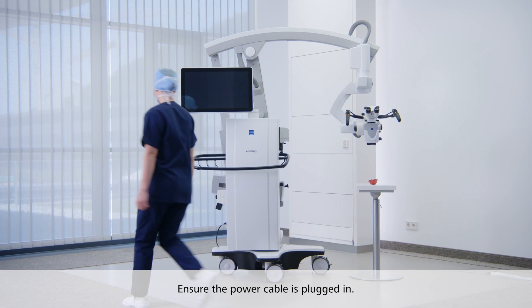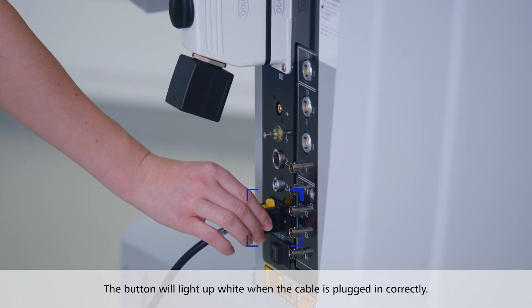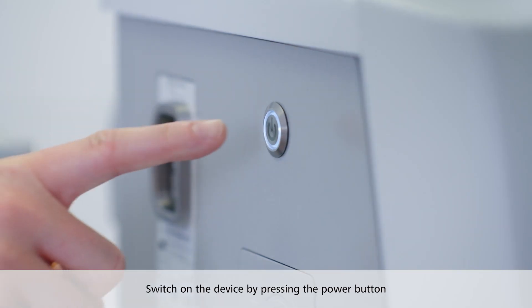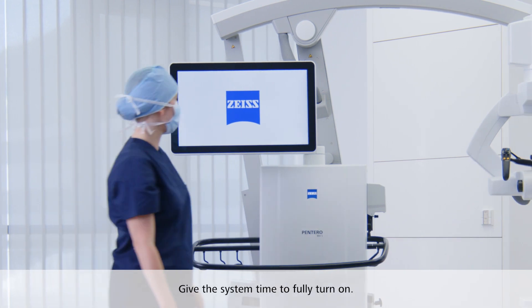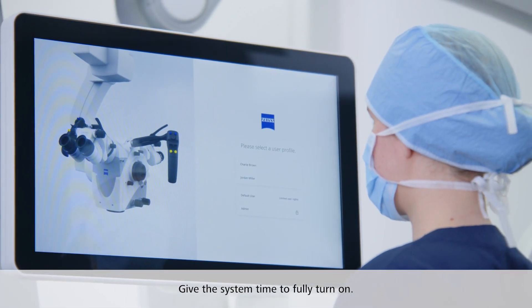To get started with your Pentero 800S, ensure the power cable is plugged in. The power button will light up white when the cable is plugged in correctly. Switch on the device by pressing the power button — it will turn green when the device is switched on. Give the system a bit of time to fully turn on until the user selection menu is visible.